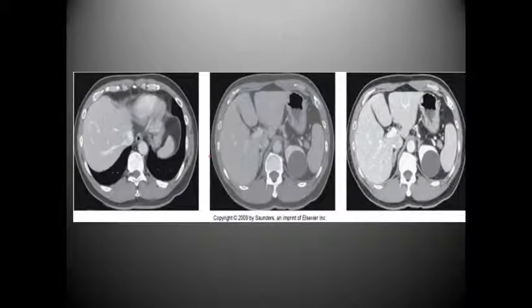Here we see an example of changing the windowing of an image. Here we have a typical abdomen window. As you can see, the contrast enhancement of the liver is quite easily distinguished. The liver is normal density, a slightly higher density than the muscle here. We see the heart having a little bit of contrast in the right ventricle, spleen coming in, aorta has contrast in it, and we see the ribs. And so this is your typical abdominal window and leveling.